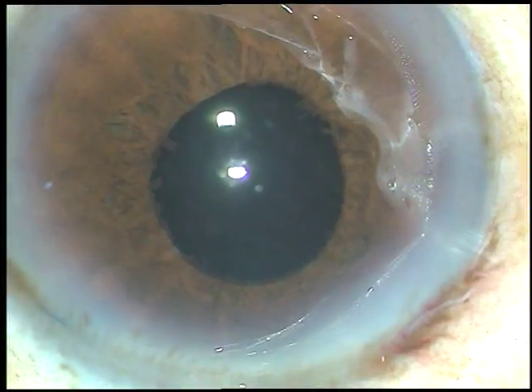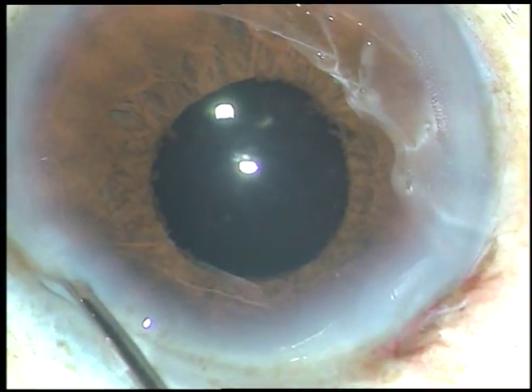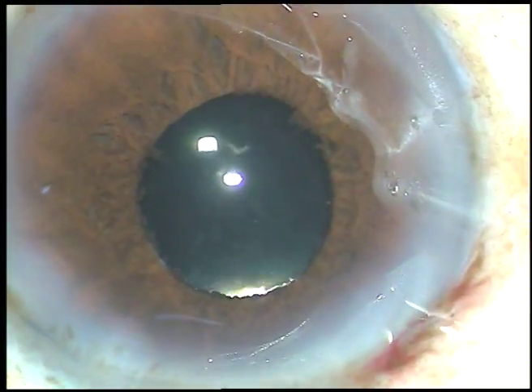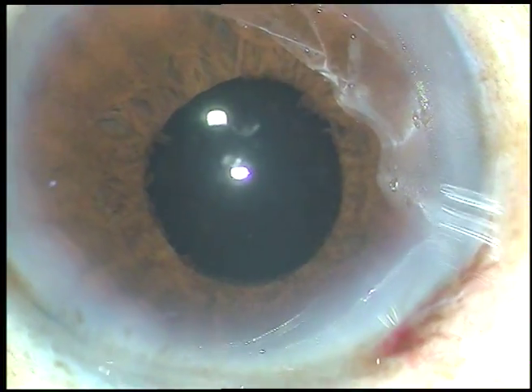And now I hydrate the side port with BSS. And this is the final look at the anterior chamber.